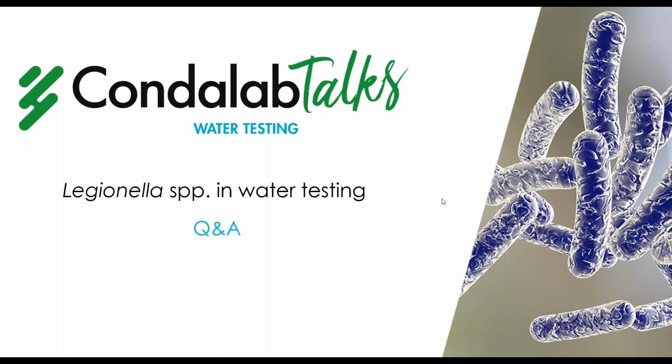You have to have growths of Legionella. The problem with all of these is that, again, these are not standardized methods. And in some of the cases, the specificity depends on the antibody used, and also there are many interferences and sources of variability. And all the positive results must be confirmed by culture, as we've mentioned.